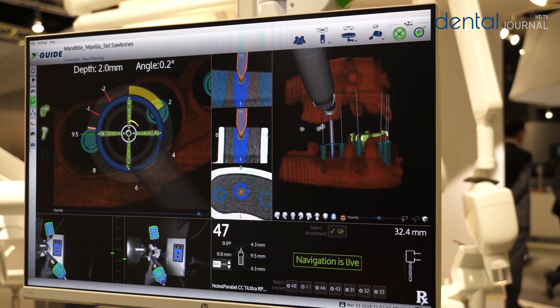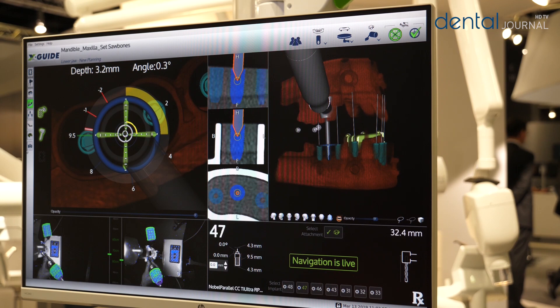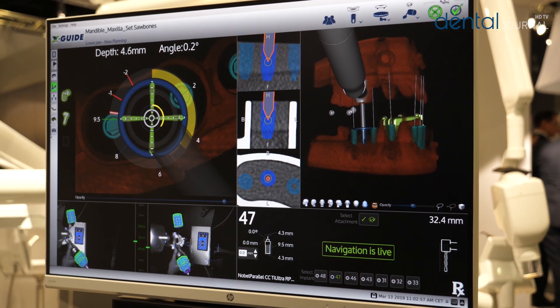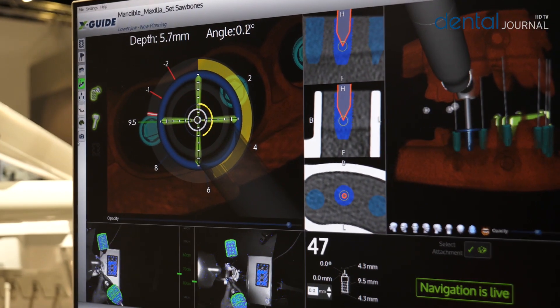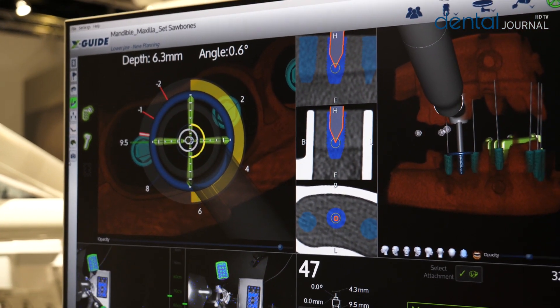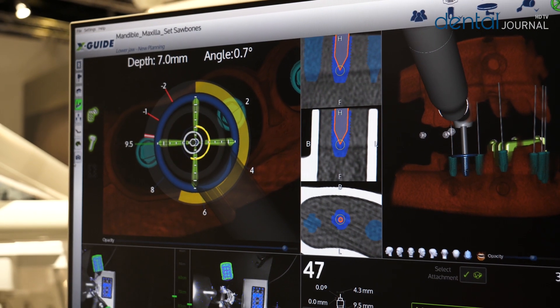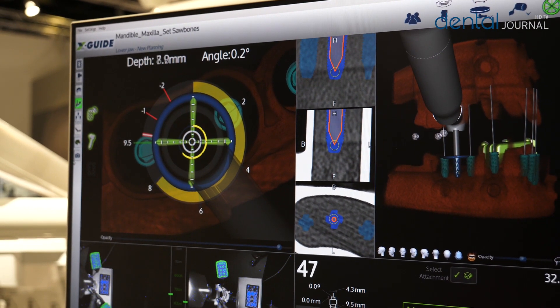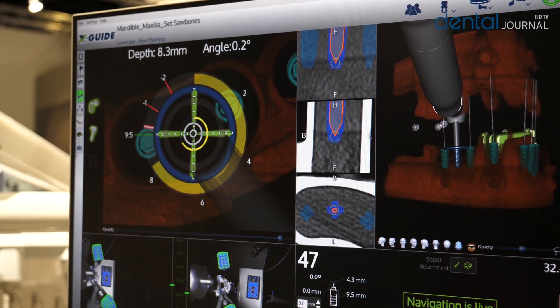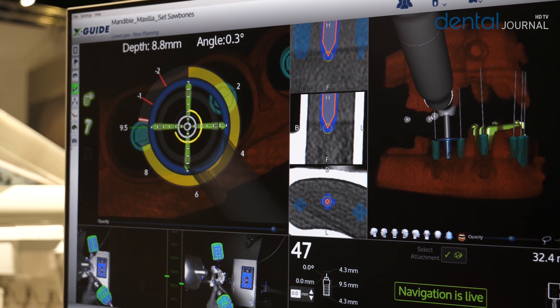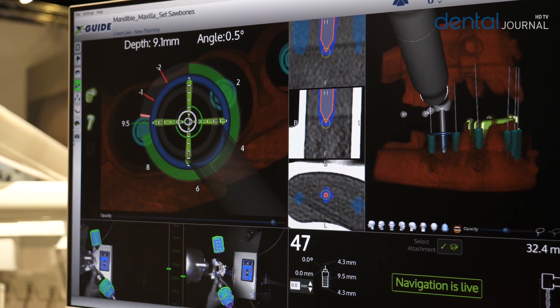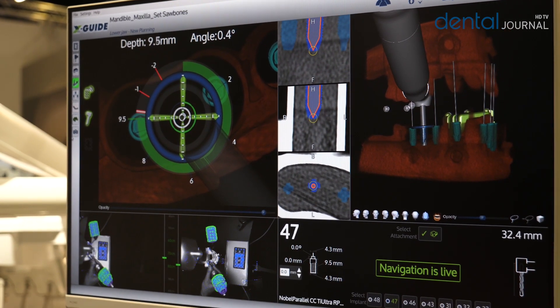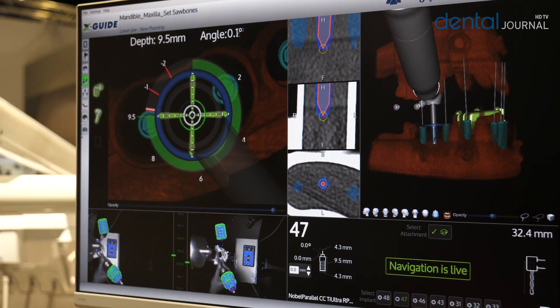As I drill down, you will see the depth meter, which is the yellow circle on the outside of the point, increasing. I'm going to stop when I get to my planned depth of 9.5 millimeters, because this is the implant that I planned in that position.